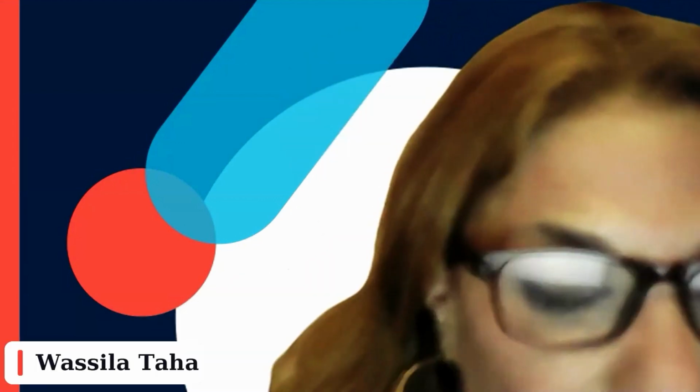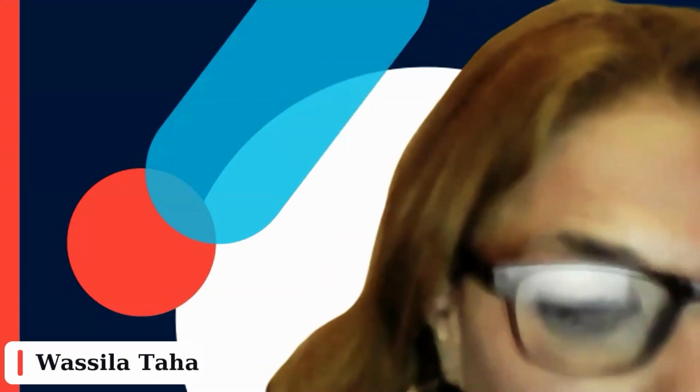Yes, this is the line of treatment. One question I asked was how to treat this superficial tributary, and another was what ratio of liquid to air you mentioned for the dry foam. Of course, the tributary I will also treat with 1%. I would just use 1 milliliter of this dry foam, 3%, for the interfascial segment.